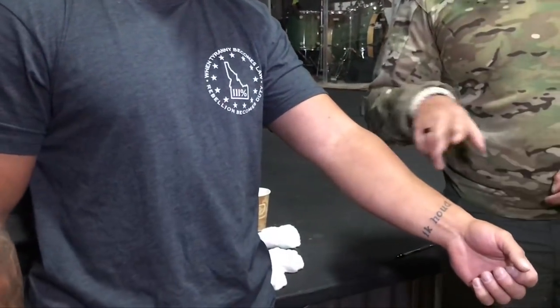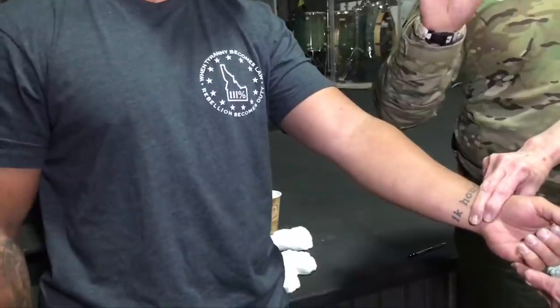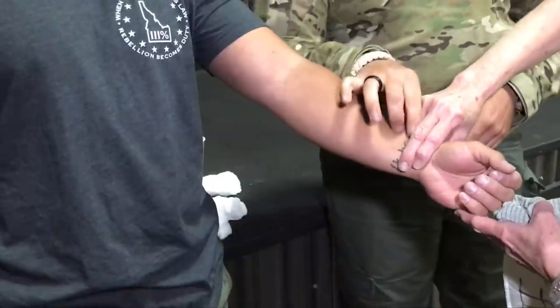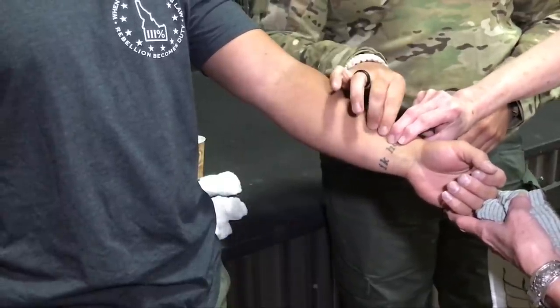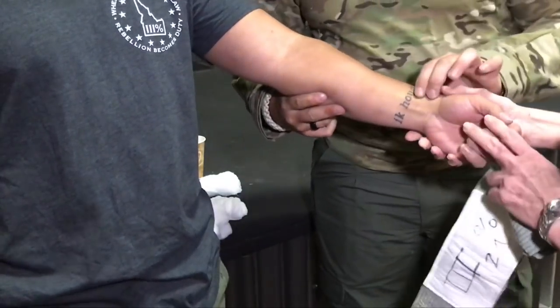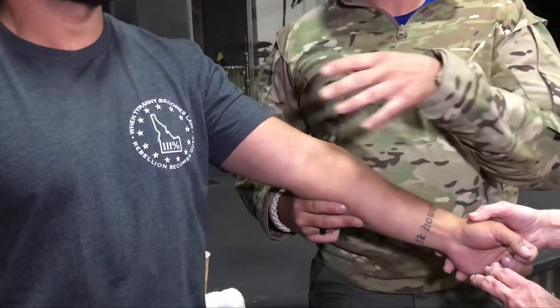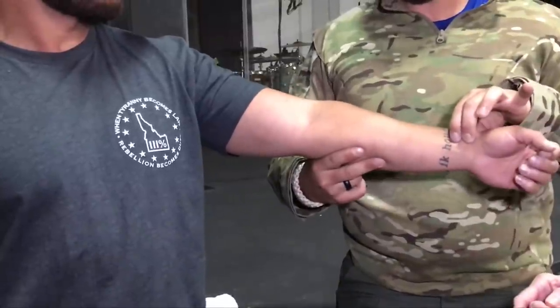So let's say we have the same injury here — a laceration. First thing, check for that distal pulse. Use your pointer finger and your middle finger. The reason is that the radial pulse coming down your thumb is pretty strong, so if you check it with your thumb you might be feeling your own pulse. Use those first two fingers in that little valley between the radius and the ulna, in that little soft spot. Why do you feel the pulse in the beginning? Because if he's got a wound and I don't feel a pulse down there, I need to tell the person I'm passing him off to that he didn't have a pulse to begin with — so we've got another issue with his circulatory system, an arterial or venous bleed.